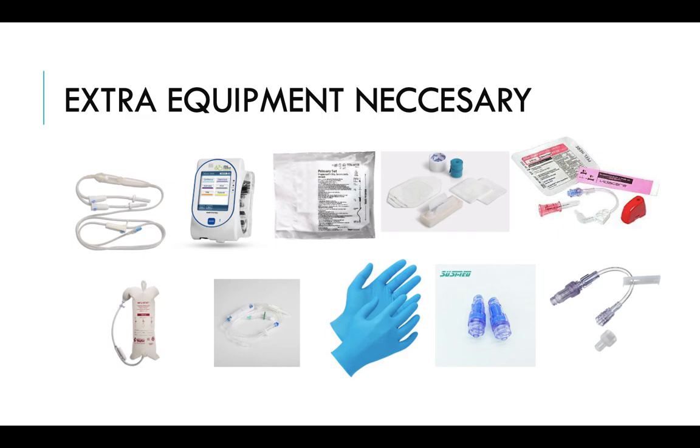Start kit, gloves and PPE, HEP locks, J loops, and then an IO kit with a specific J loop in it. The IO J loop is specific to the IO, and the end of it where it connects to the hub for the patient is a 90-degree.